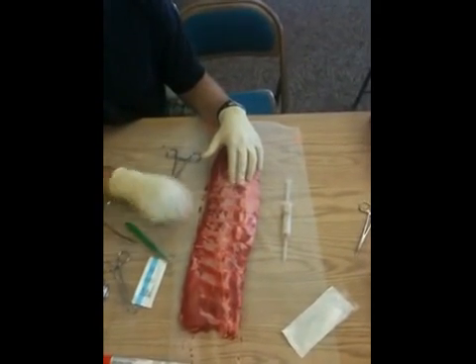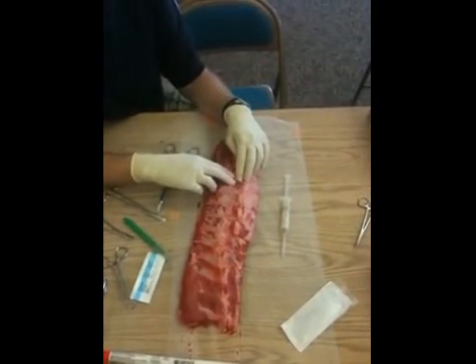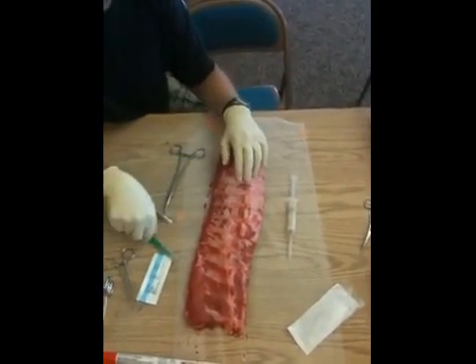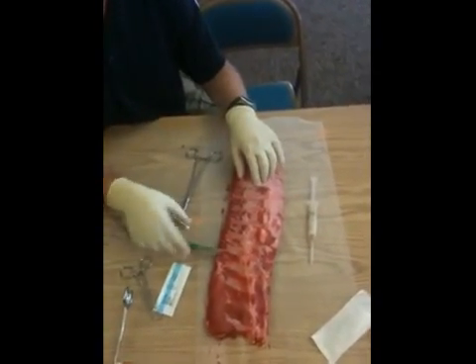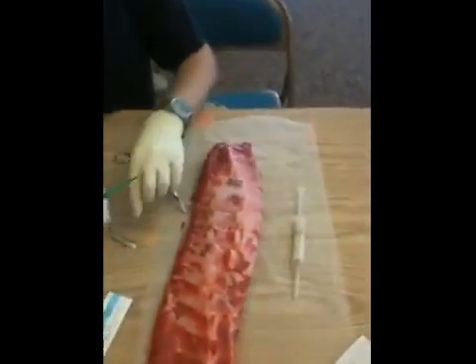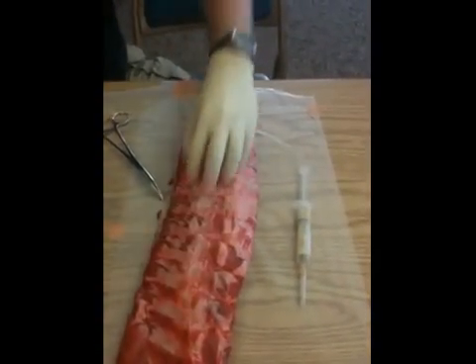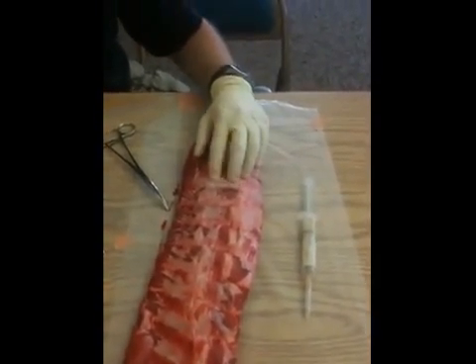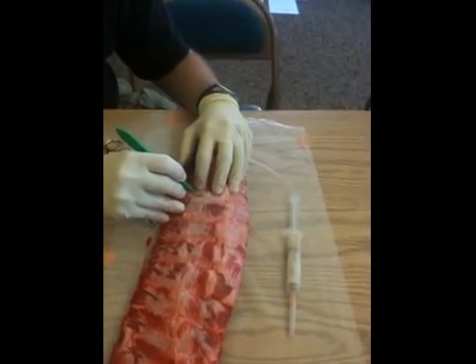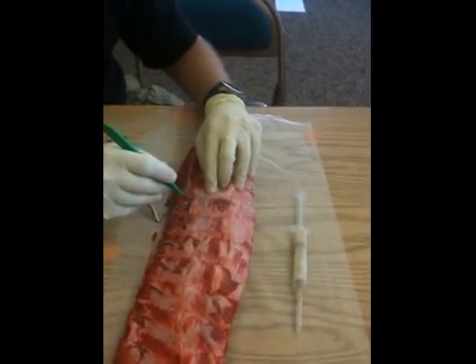I've only actually done about half a dozen chest tubes on living people, so I'm certainly not the definitive resource when it comes to chest tubes. I've got my landmarks and equipment ready. I'm going to make that initial incision. It's a bit difficult because you don't really have subcutaneous tissue on this model. I want to make it big enough to work with, right on top of the rib.